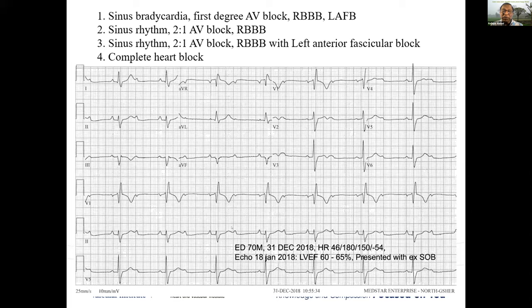And if it is a second P wave, let's go back up. We can see it everywhere. This is lead 2, but in lead V1 I can see something that looks like the terminal part of the P wave. Even Hafiz cannot disagree with me on this one. But Rafique, my point is, we also need to be worried about infrahisian block in this patient, right? Yes, because I would not leave this patient after 5 o'clock without a temporary wire if he's coming with dizziness or syncope.